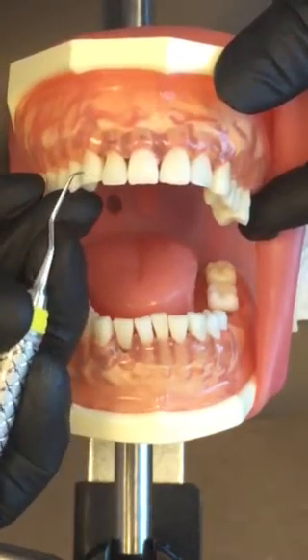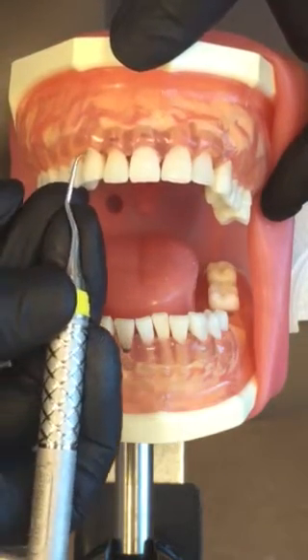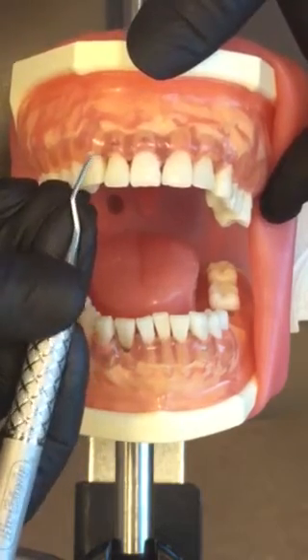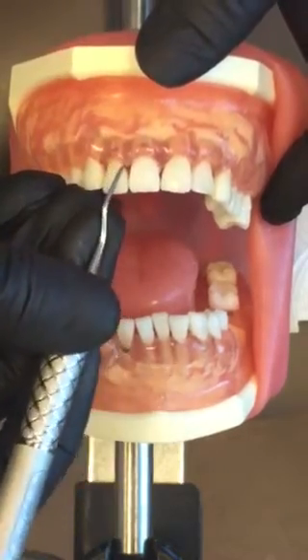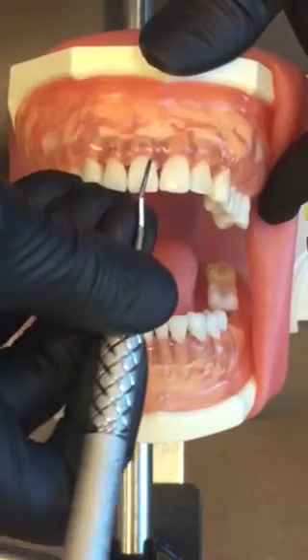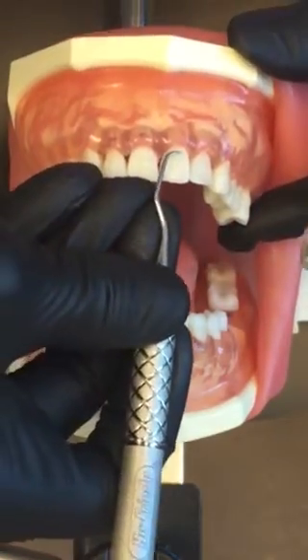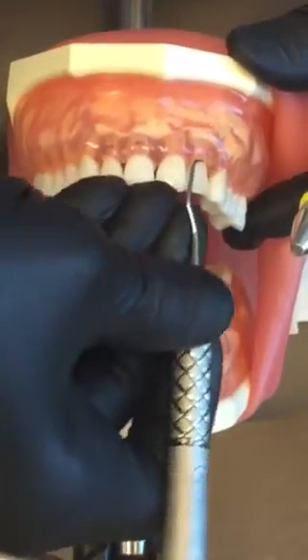So from canine to canine, if I'm working at 12 o'clock, I'm going to start and do my surfaces away from me. I'm going to lower the blade down to the junctional epithelium, go midline around midline to the mesial. You can tell my handle is almost just an extension of the tooth — I'm keeping it as parallel as possible. The Anna Paterson Gracies are offset at 60 degrees so they already provide a perfect working angle, and I'm maintaining palm up.